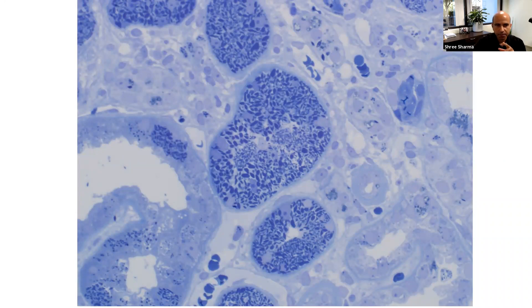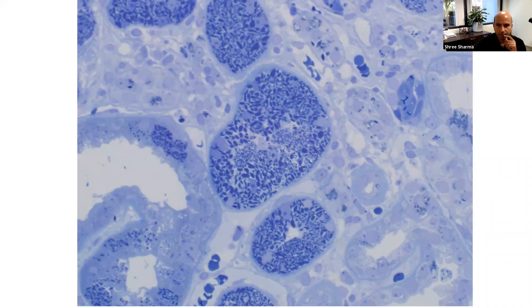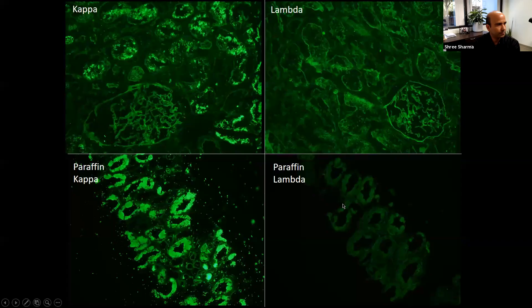The IgA image shows a classical mesangial location. Capillary wall deposits are seen in the periphery in membranous, while mesangial deposits define IgA nephropathy. These patterns are key differentiators on immunofluorescence.